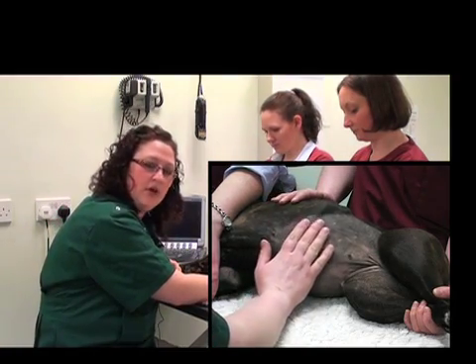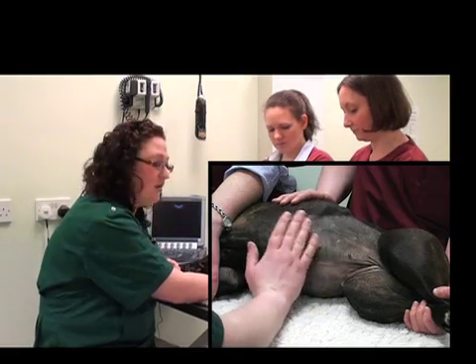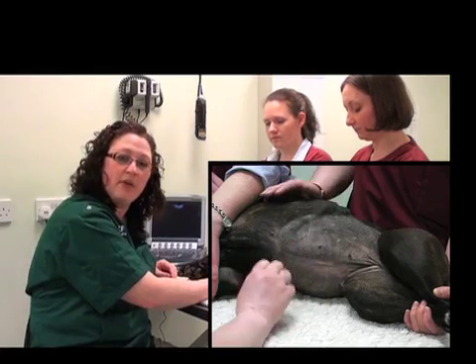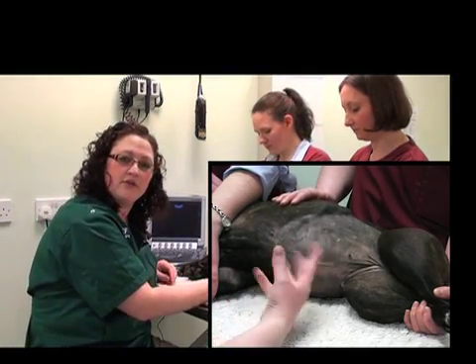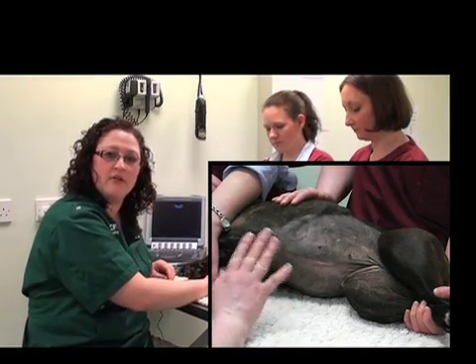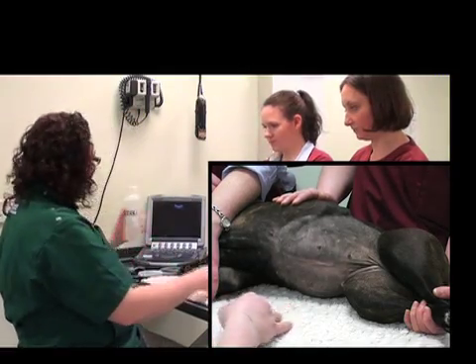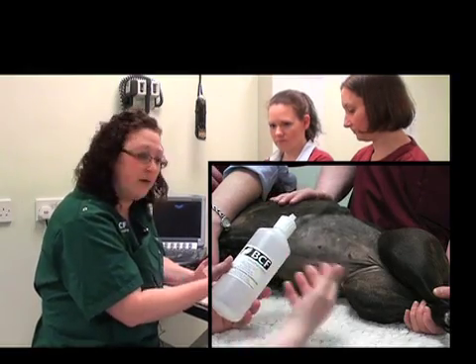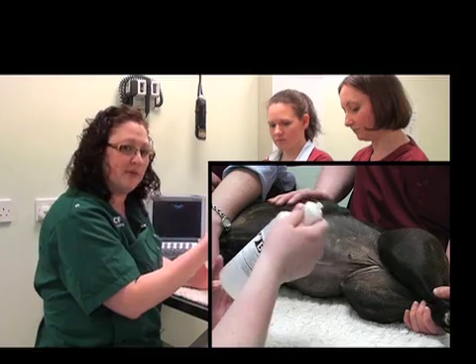You'll also want to place a good amount of ultrasound gel on the surface of the skin. What can really help is to allow that to sink in for about five minutes before you actually start your examination. This will allow it to soak into the skin so that the first initial images you get are as good as they could possibly be. You'll also want to use gel throughout the examination to top up, and it can help if you warm it up a little bit first too.